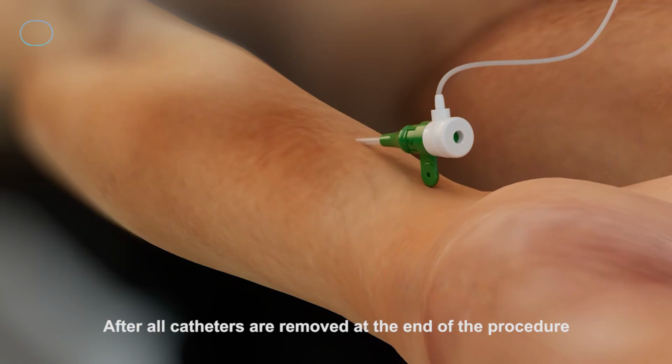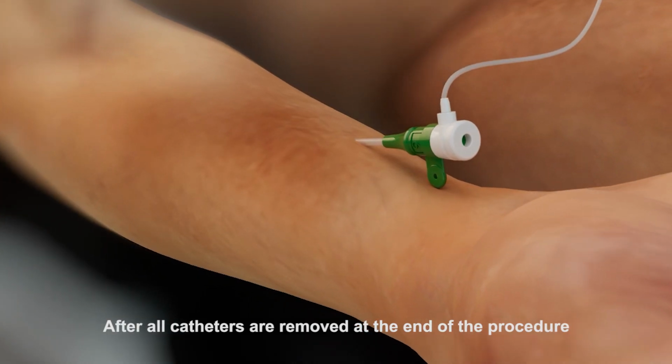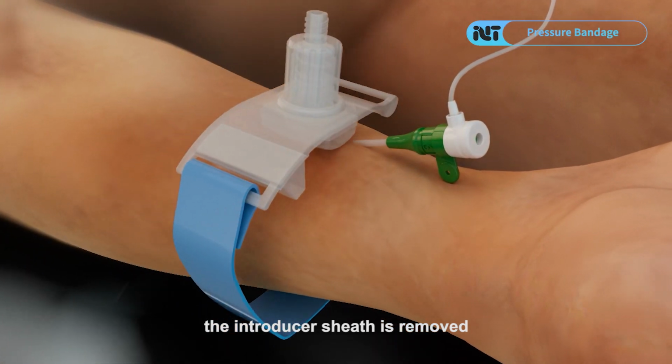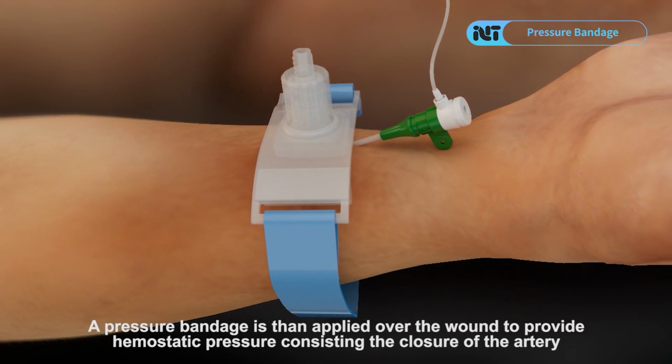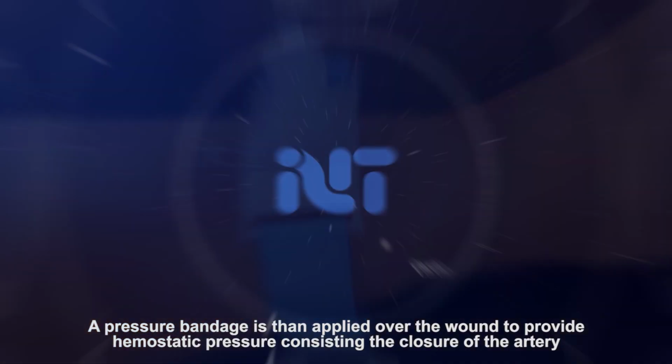After all catheters are removed at the end of the procedure, the introducer sheath is removed. A pressure bandage is then applied over the wound to provide hemostatic pressure, assisting the closure of the artery.